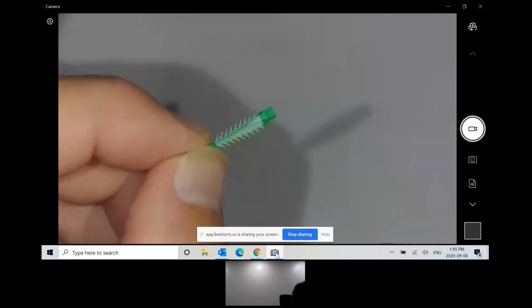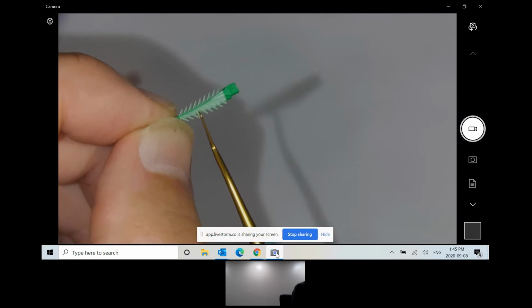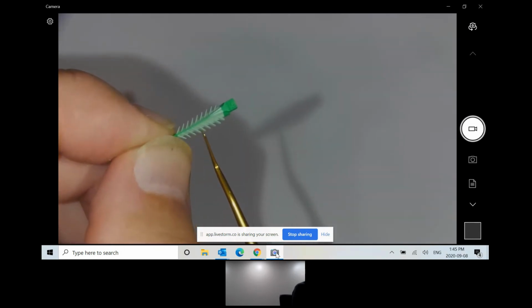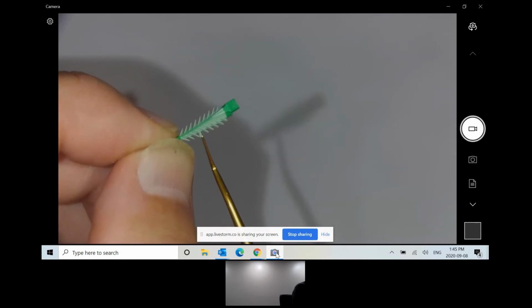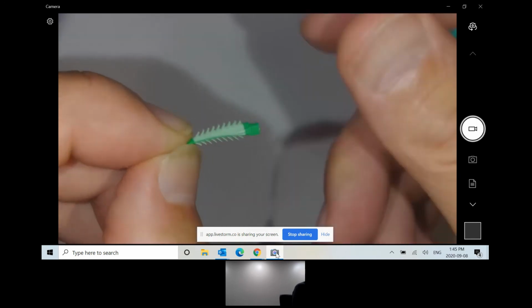This little wedge from Garrison was certainly a step in the right direction. But as I alluded to, these little plastic fingers are so flimsy that they're not going to provide any separation or seal the matrix band well on the lingual aspect.